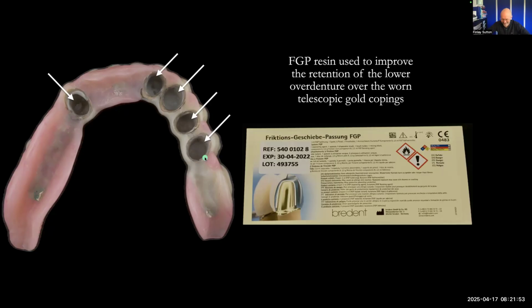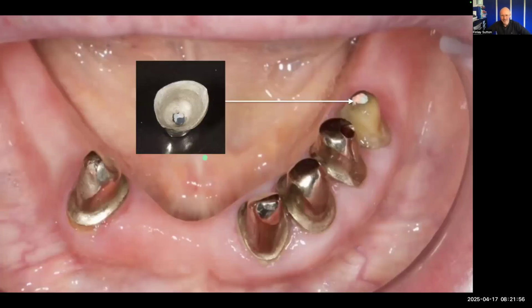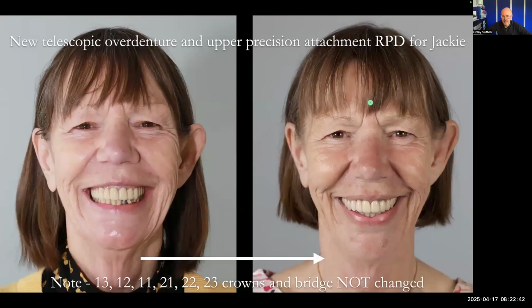When I was doing this though, there's always things, aren't there, that happen. That gold coping came off the root treated tooth there. So I sandblasted and cleaned it up and then re-cemented it in place using Fuji Plus cement. Whilst I was re-cementing it, I mixed up the cement, put that on, and before the cement set, I made sure that the removable denture was sitting properly over the top of it, biting together, so that the gold coping was properly seated in the mouth. So that's the case there, finished.